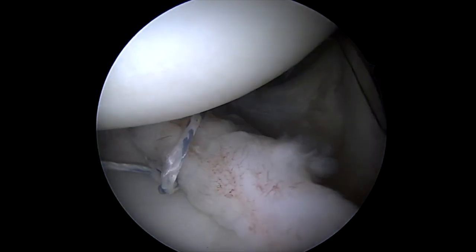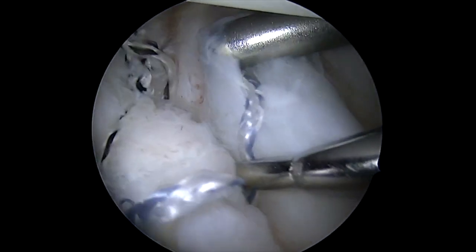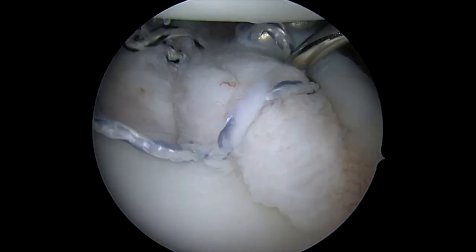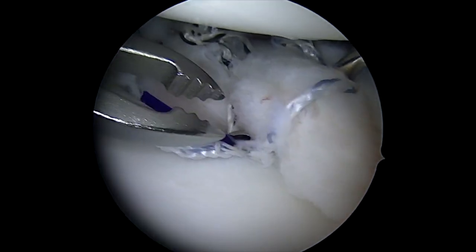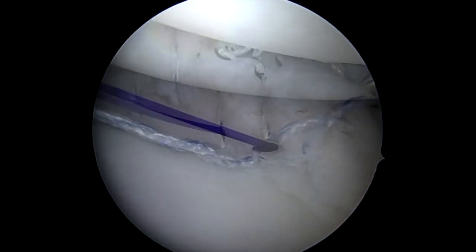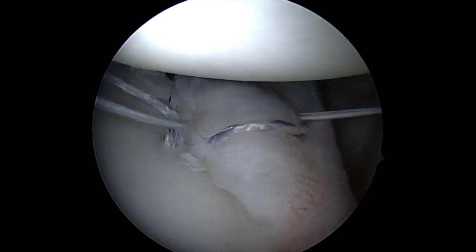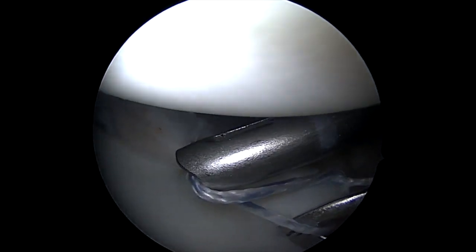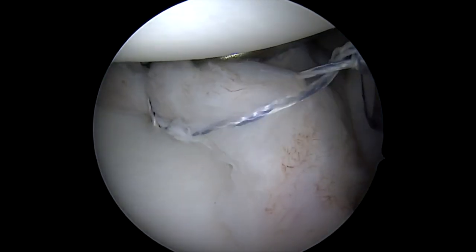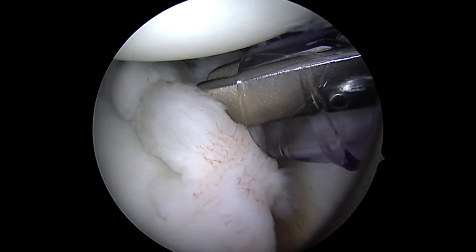If I can't get it to come from the back, then we'll try from the front. Typically you can get two or three, sometimes four passes from the back before you have to switch to the front. Switching back and forth helps you get different vectors on the capsule, which helps to spread the sutures apart and hopefully gets even more compression of the capsular tissue, creating that nice bumper of tissue you can see right on the edge.